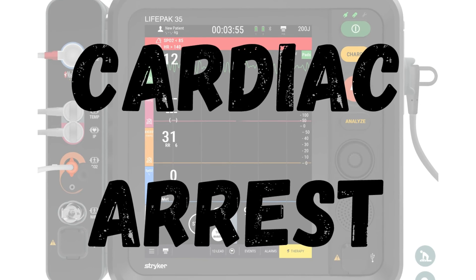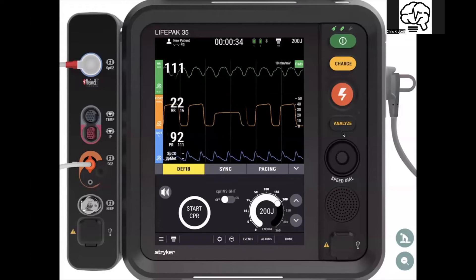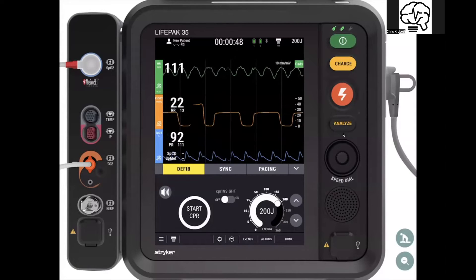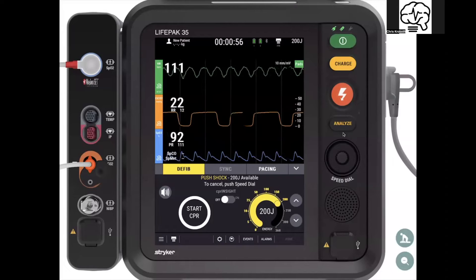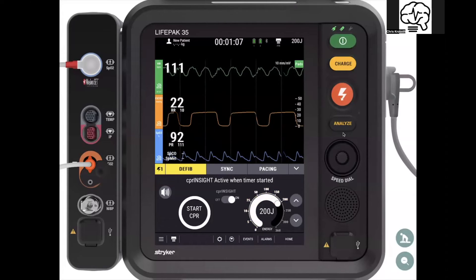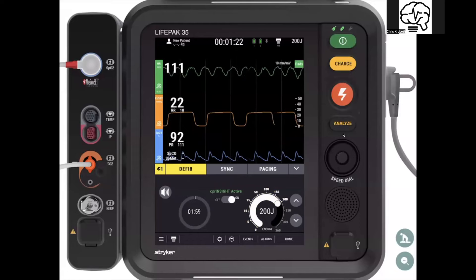Let's talk cardiac arrest. Start CPR and we have our therapy dashboard. When you hit your initial charge, it charges up to 200 joules — clear, shocking, delivered. Now you see the CPR Insight button. When you hit CPR Insight, it does a back-end analysis of the underlying rhythm and tries to discern shockability. If it finds that rhythm to be shockable, it will actually pre-charge prior to the end of that two-minute cycle — which is an awesome feature.